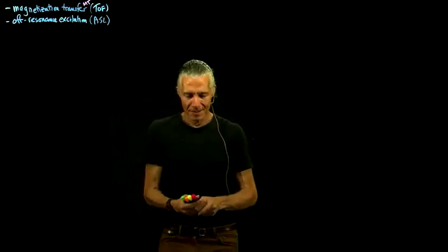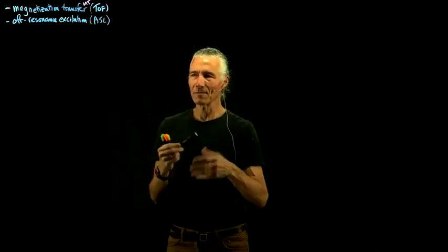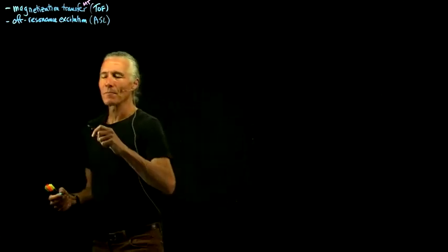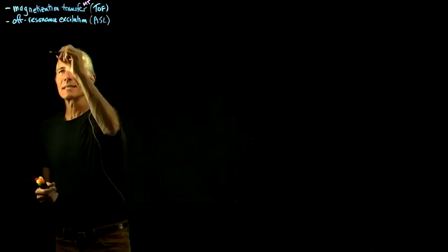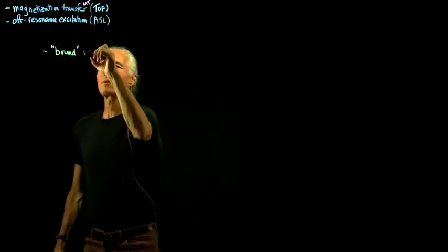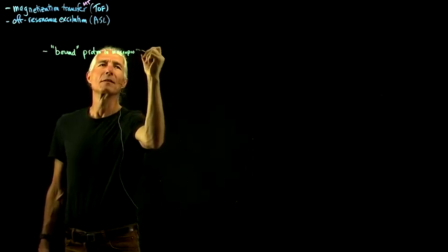But as I was watching my video from last year, I said, I don't really completely understand magnetization transfer, especially the physics of how it works. But we'll just go over the main points and how we actually use it. And so, what is the distinction? Well, it's the distinction between what we might call bound protons in macromolecules. So you have a lot of proteins in your macromolecules.